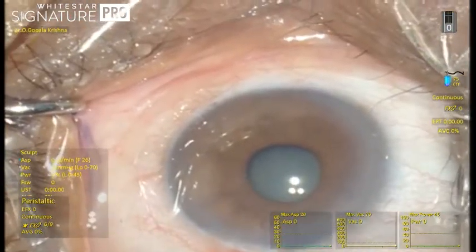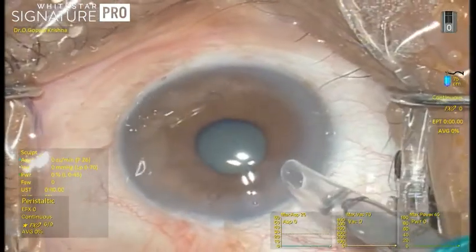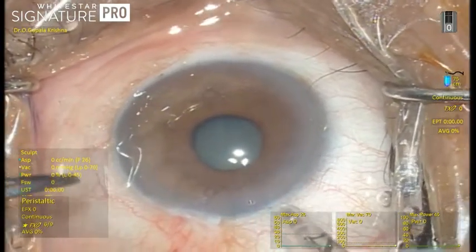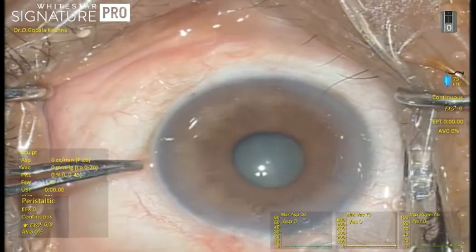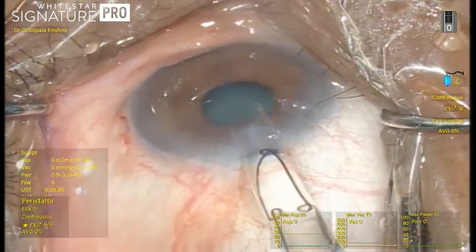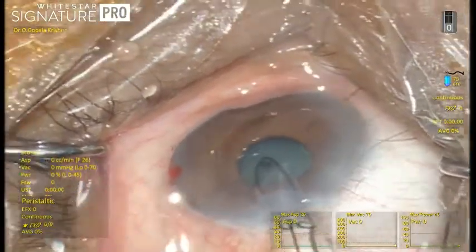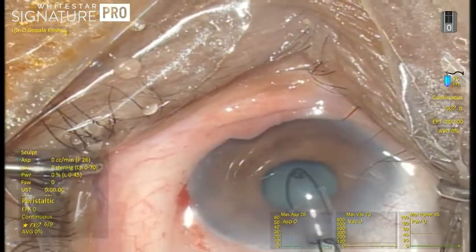This section is 2.6 millimeters, through which the injector goes smoothly. It cannot go through a 2.2 millimeter incision — it needs at least 2.6 to 2.8 millimeters for easy injection. This is a straight push-tap injection and the leading edge will have an open scroll.